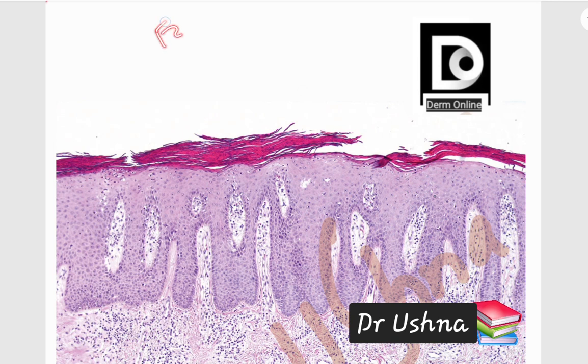We have a basic layer of skin. We have epidermis, then we have dermis, then we have subcutaneous tissue. These are the basic layers of the skin. And being a dermatologist, you know that the epidermis has 5 layers. You can easily remember the layers of the epidermis by the mnemonic CLGSB. Okay. So corneum, lucidum, granulosum, and then spinosum and basal. This is the basal layer, then CLGS: corneum, lucidum, granulosum, spinosum. These are the stepwise layers of your epidermis. While looking at the slide, you cannot ignore each of these layers. The layers are so important for your description of the findings of your histology.